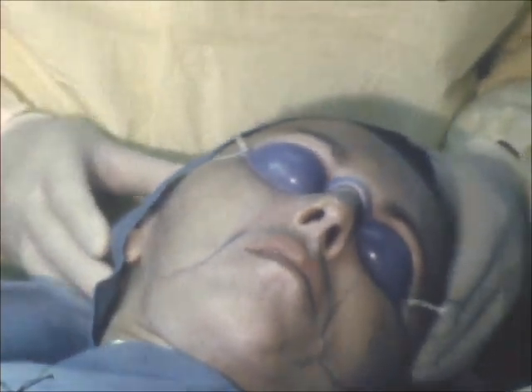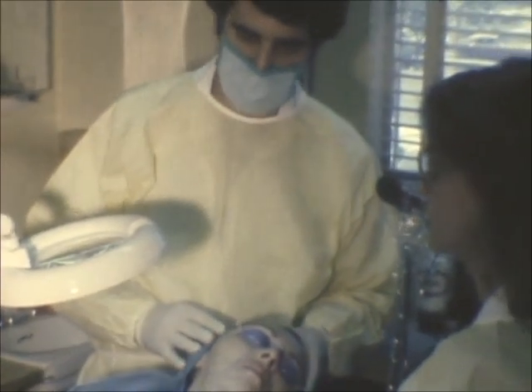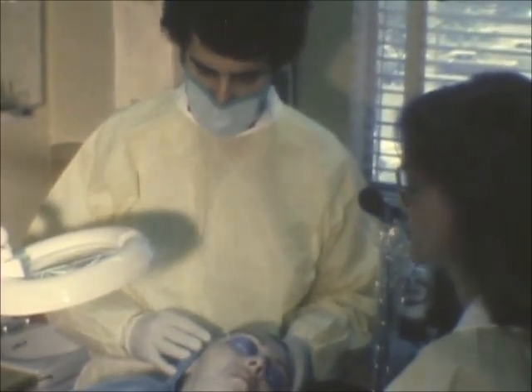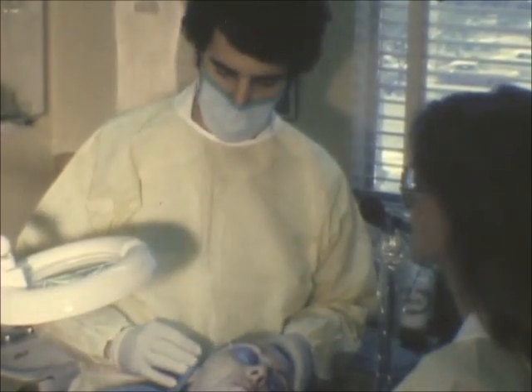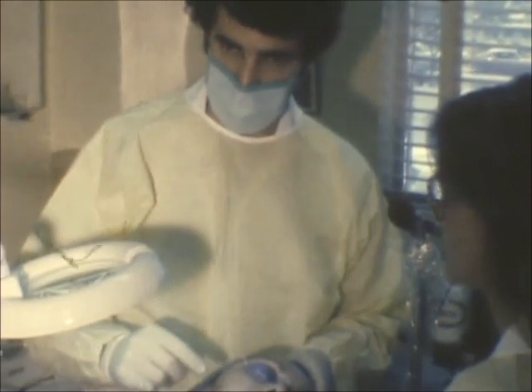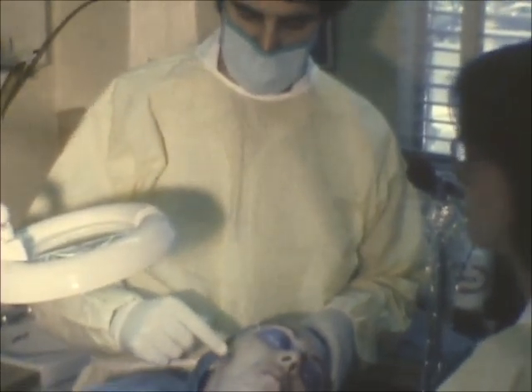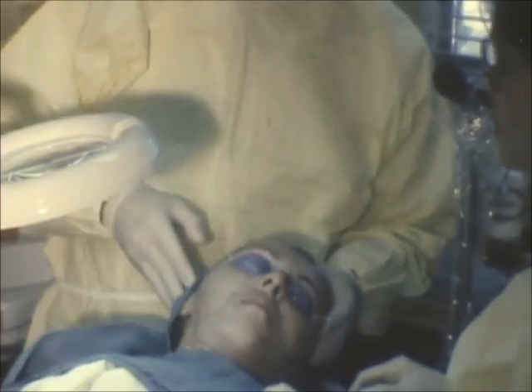At this point the patient is prepared now for the dermabrasion. The chemical has been applied — the trichloroacetic — and a white coagulum has formed all over. This softens the skin, making it easier for the brush to glide over the skin for the dermabrasion. The area of involvement, in this particular case scarring, is outlined with a marking pencil on both sides.